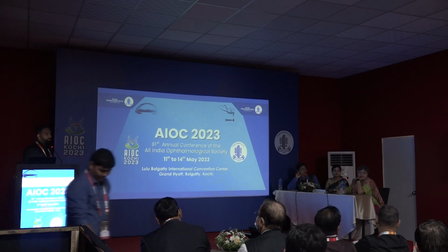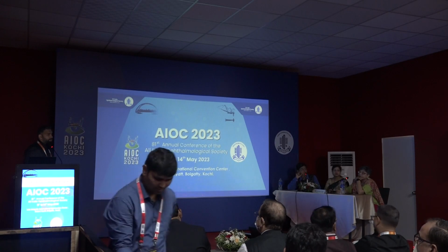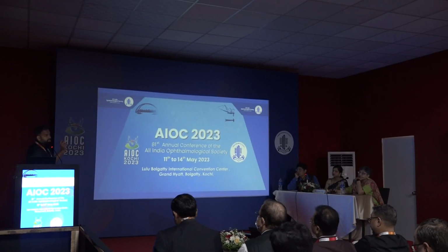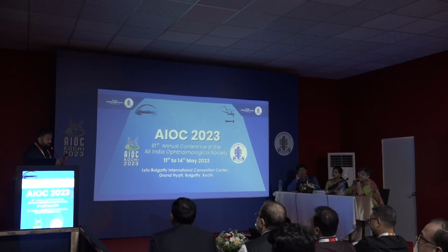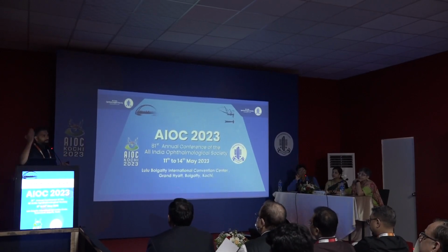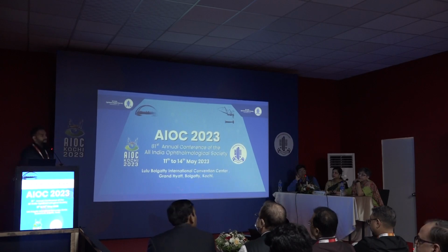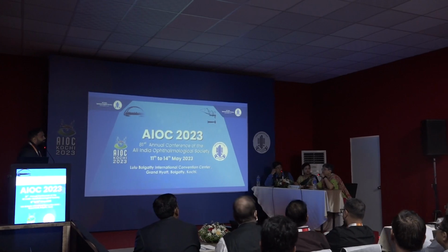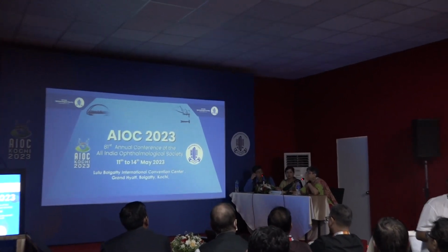Any comparison using the ophthalmoscope slit and your slit? What is the difference? Actually, the ophthalmoscope slit is a little thicker. If you see this one, this is actually very thin. You can actually get a very good slice of the lens.